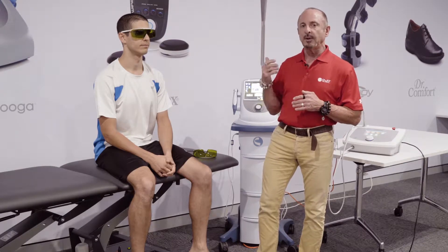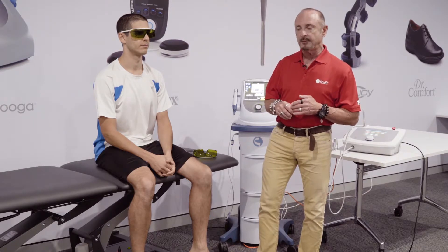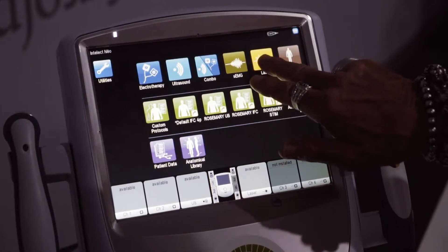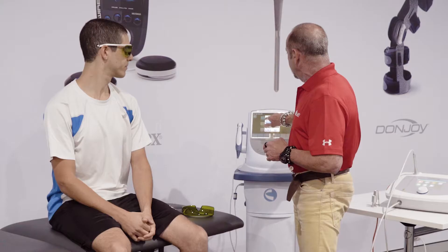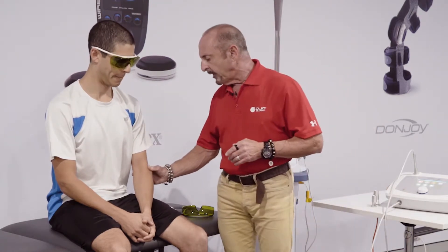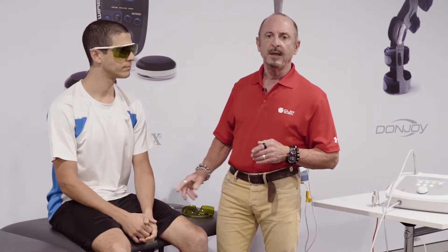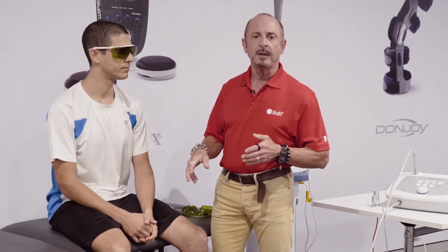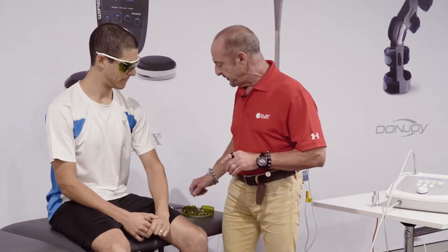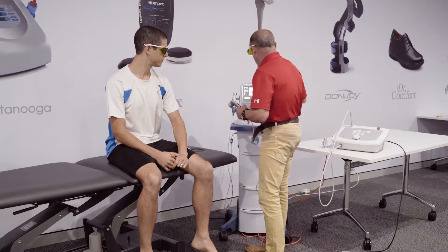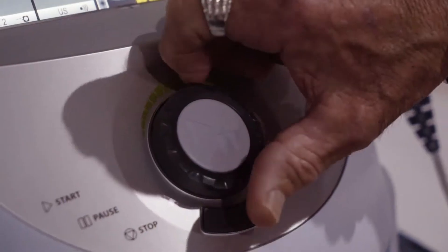For today's demonstration, we're going to use the Chattanooga Neo for low-level laser. Coming over to the user interface, I click on the laser icon, put in my code, and I'm ready to go. We've already identified a very superficial lateral epicondylitis on this patient. Our treatment size is roughly the size of a smartphone or a playing card — extremely superficial. We put our goggles on for eye protection and set our desired dosage.